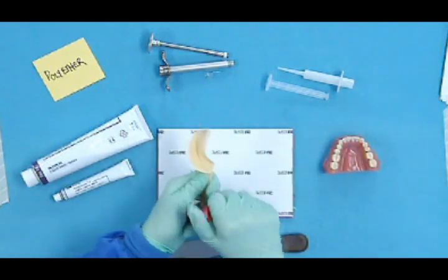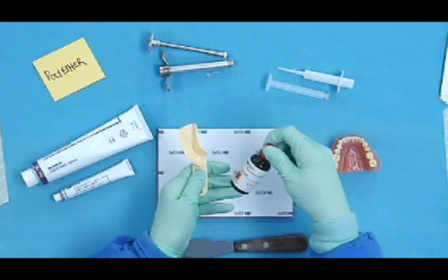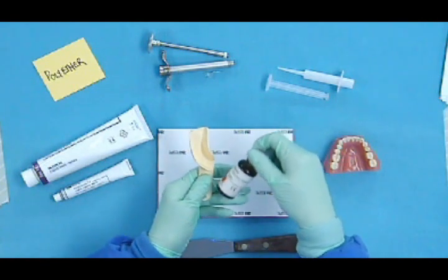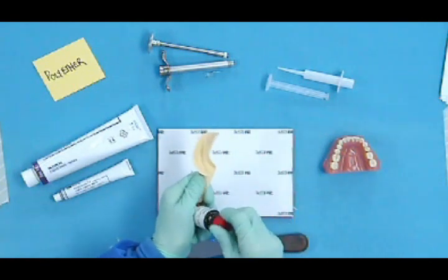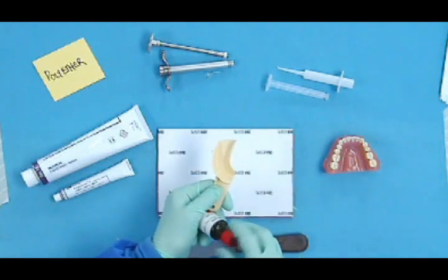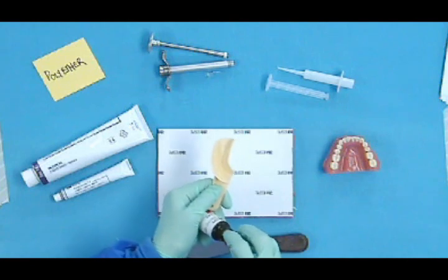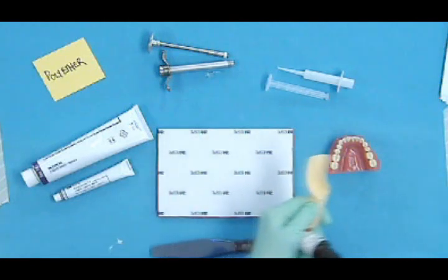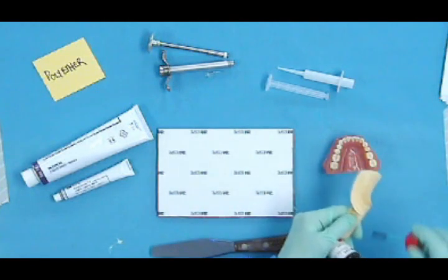Again, we have an adhesive that is specific for our polyether, and we have an impression tray that doesn't have any perforations in it, so that the material with the adhesive will stay in the tray.